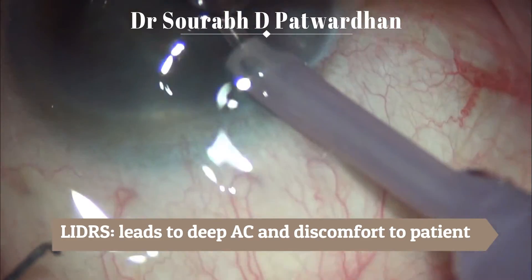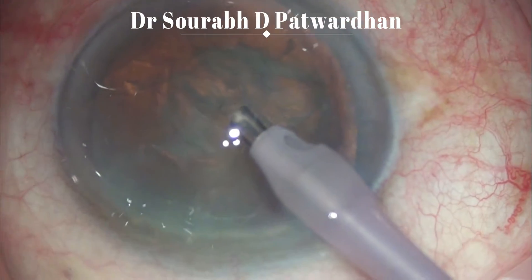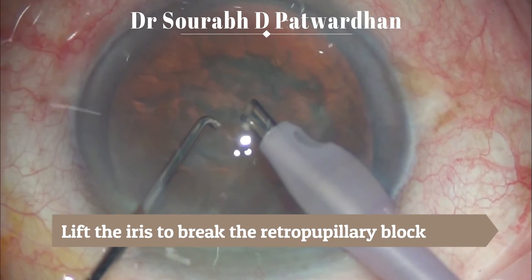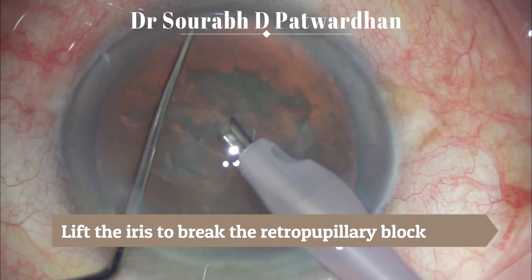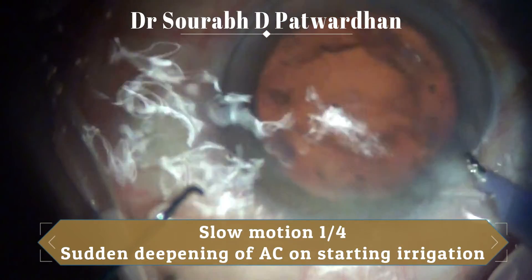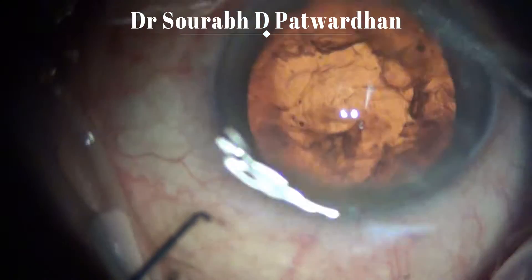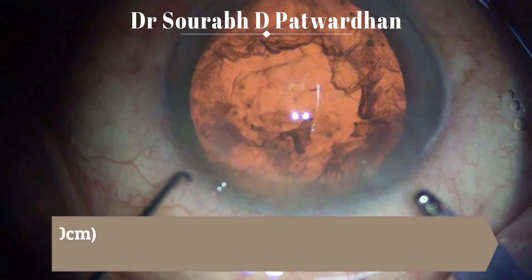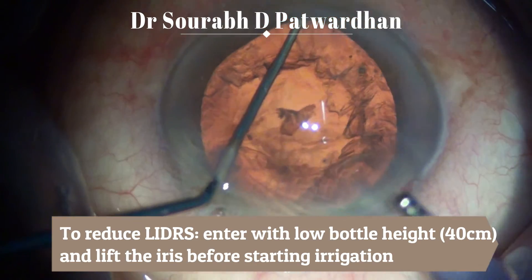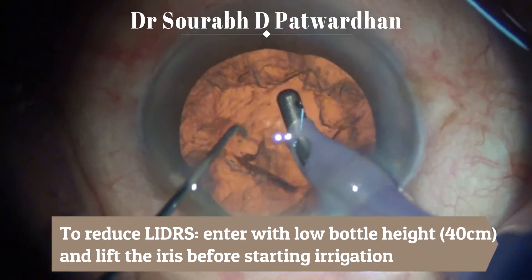Lens-iris diaphragm retropulsion syndrome leads to a deep anterior chamber and discomfort to the patient due to reverse pupillary block. To remove this block, it is important to lift the iris so the block is reversed and the anterior chamber becomes normal. In slow motion you can see that because of irrigation there is sudden deepening of the anterior chamber. To reduce this, lower the bottle height before you enter the anterior chamber, lift the iris up, and then slowly enter with low intraocular pressure.